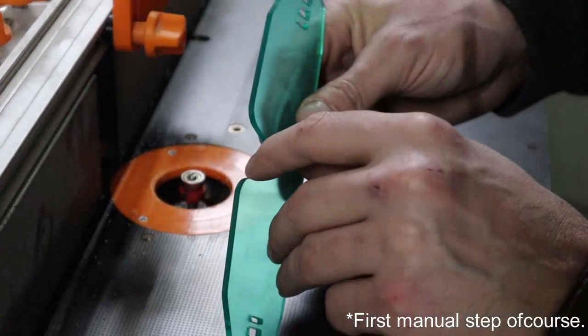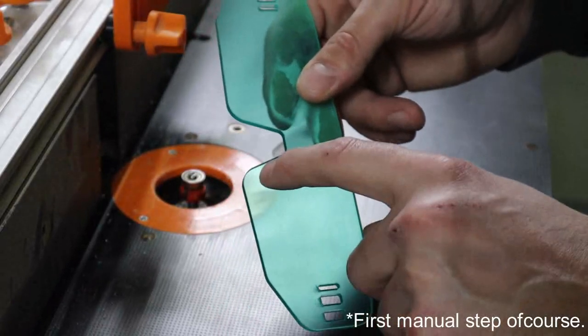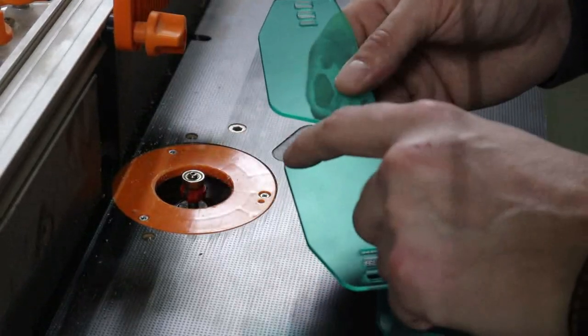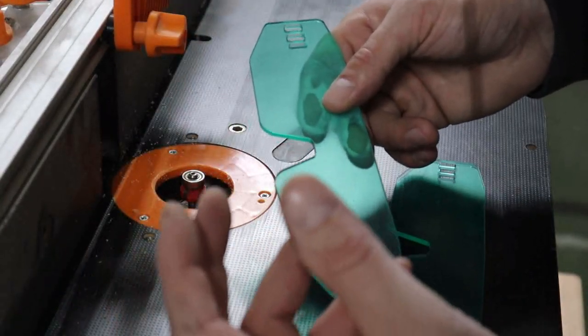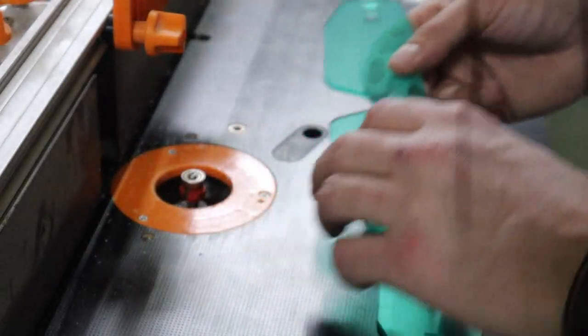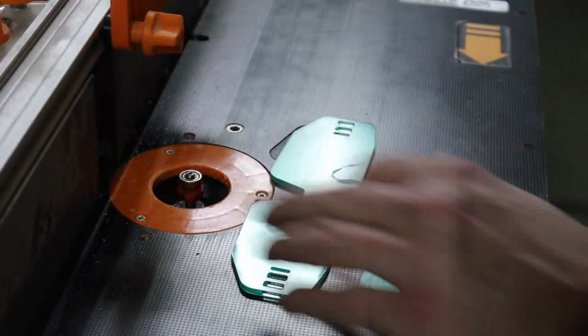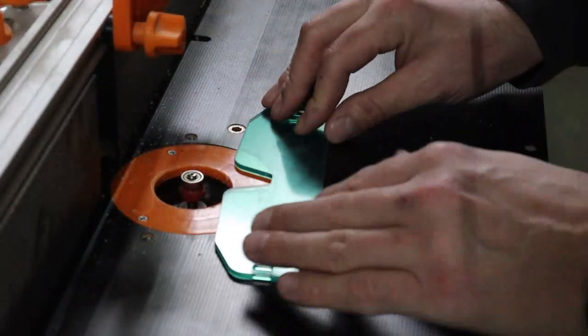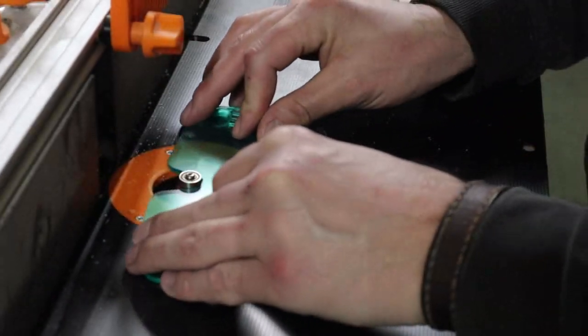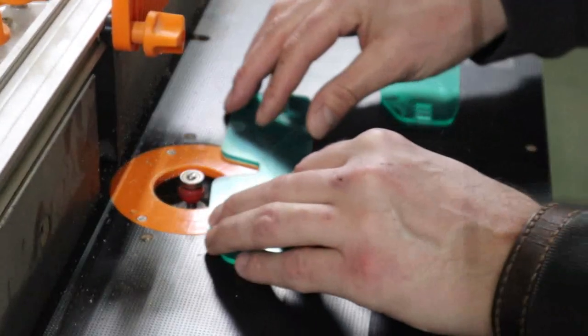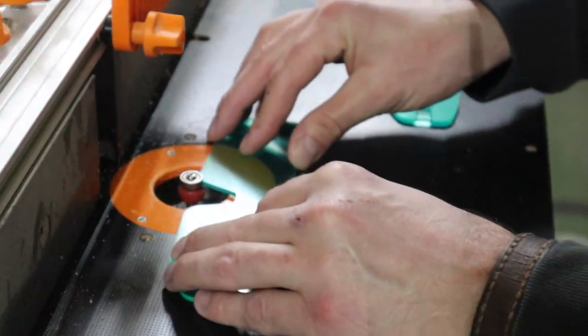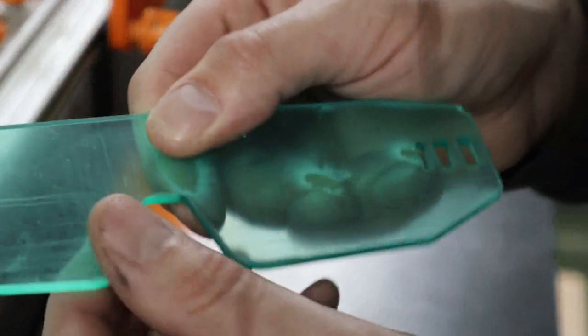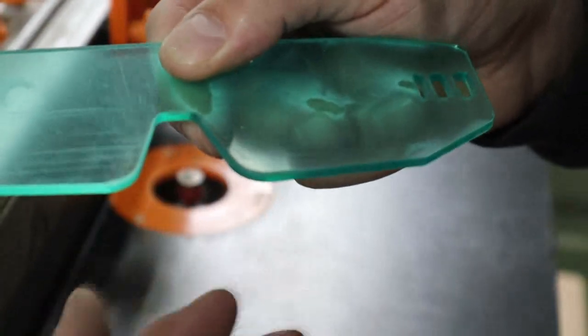The first step is using a table router to deburr this sharp edge. We're going to make it round because it will touch the face mask, and if it's too sharp it can potentially damage the face mask and compromise the person that's wearing it. We use a simple routing table, low RPM—that's the most important thing, otherwise the plastic will start to melt. Now you have a nice clean round edge along the nose piece, and this will protect the mask.